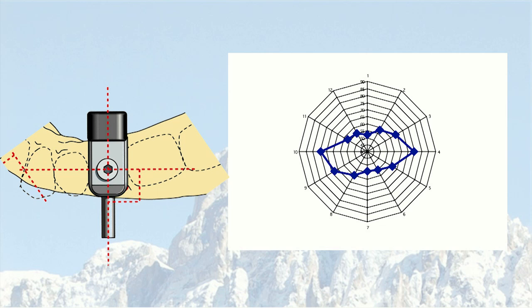With the wire technique, there were some drawbacks. For instance, we could, in a single tooth situation, only place the transducer in buccolingual or buccopalatal direction. And we know from measurements we did in edentulous patients that if we are rotating the transducer, we can actually measure different stabilities in different directions. And usually the implant is more stable in mesial distal direction since we have more bone to support, and we have less stability in buccolingual direction since often the bone is thinner. And with this technique, we actually missed the higher stability in mesial distal direction. And at that time, recommendation was actually to place the transducer like that.